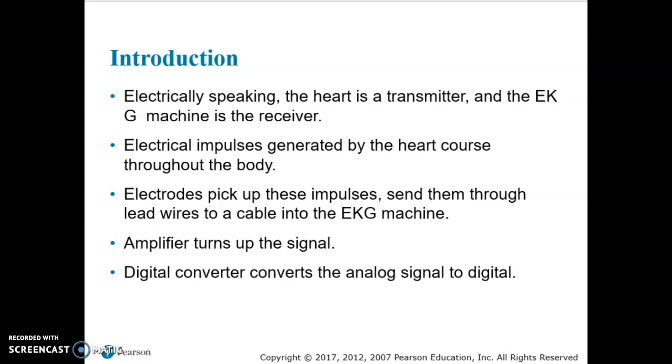So they're able to put the EKG on the patient, and through the internet it will send it to the emergency room that the patient is going to, and the doctor can be studying that strip, and the doctor may even say, I want you to give this patient X amount of this medication while you're en route to the hospital. That gives them time to know what they're dealing with.